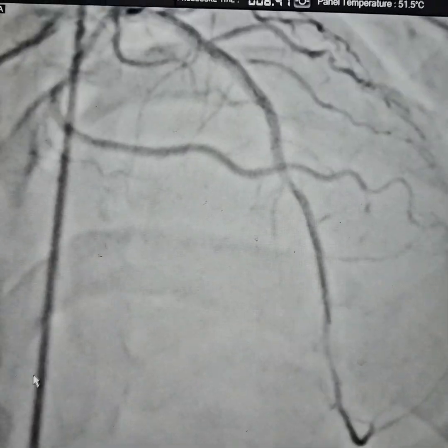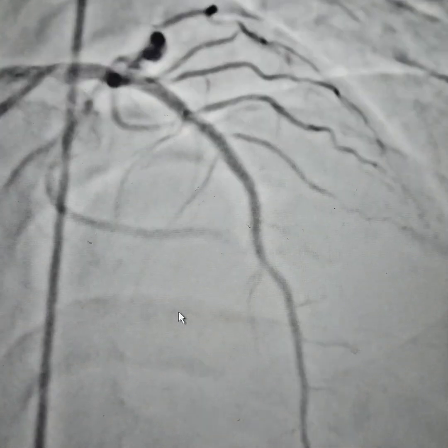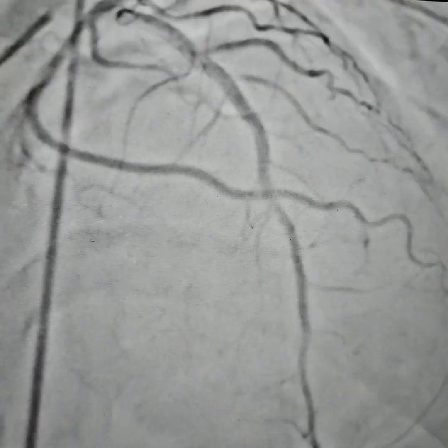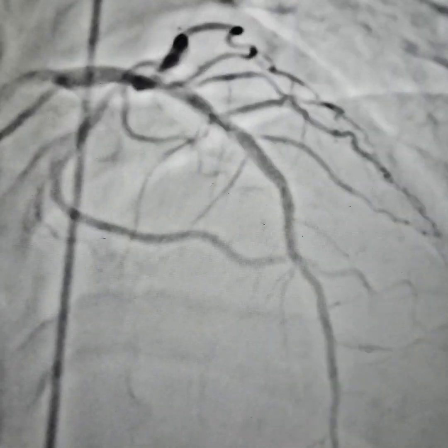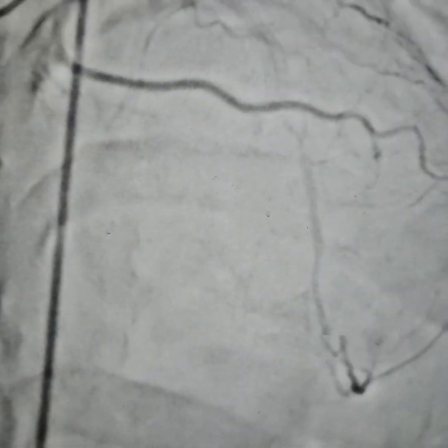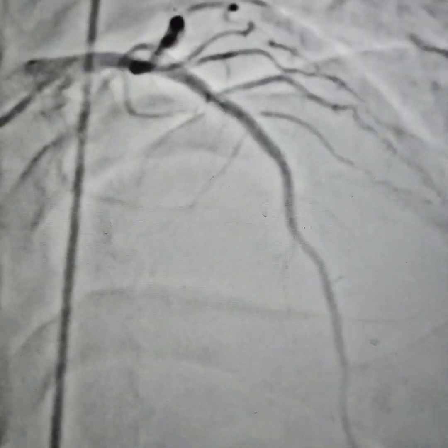The artery has opened up very nicely — flow has been well achieved and the patient is stable. We used the femoral route because of the very tortuous artery and the LV failure; we did not want to waste time trying to hook the artery via radial. The patient was mobile in six hours.